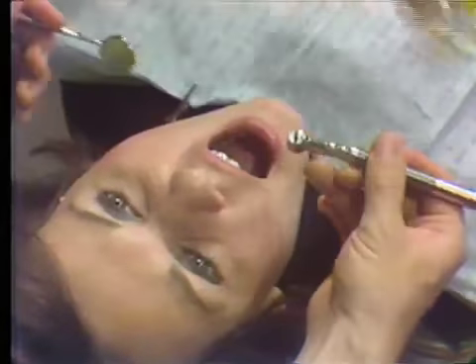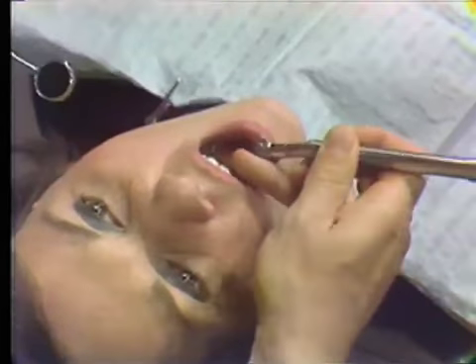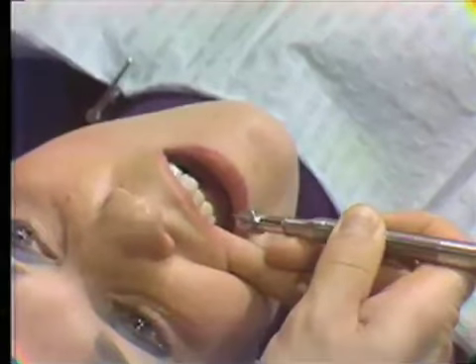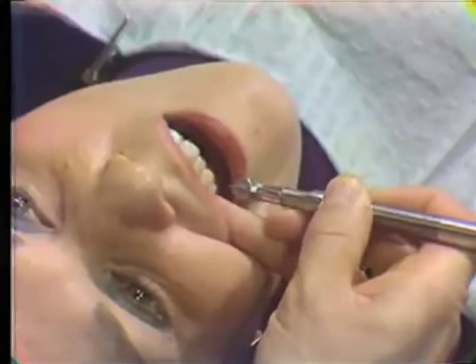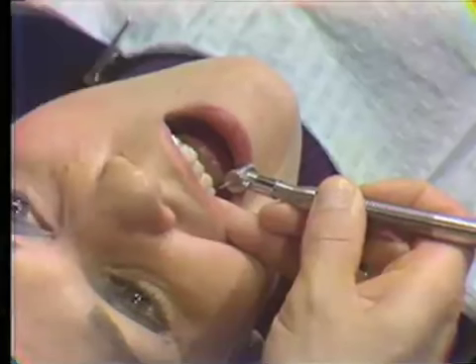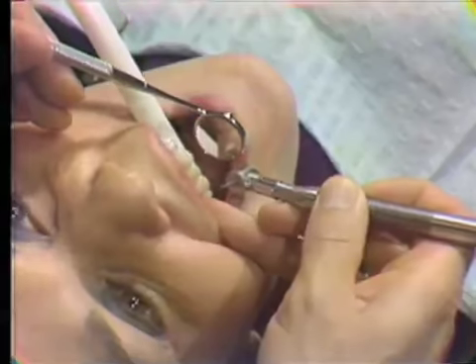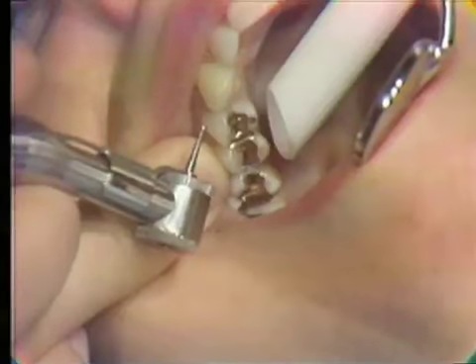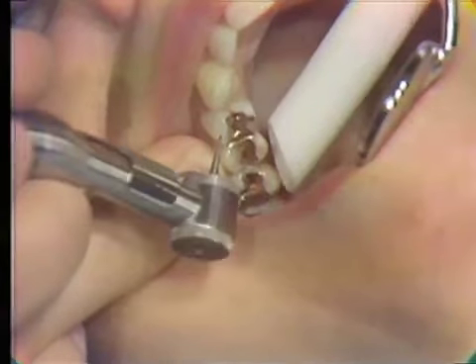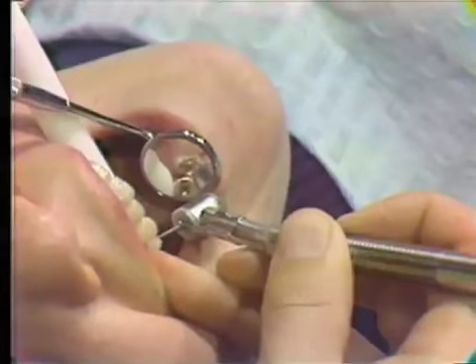Most operators have solved this inconvenience by using the third finger of the right hand to establish a rest against the buccal surfaces of the posterior teeth. The finger also serves to retract the cheek at the same time. A cotton roll placed in the mucobuccal fold aids in the retraction function. The evacuator tip is placed along the lingual surfaces of the posterior teeth with the opening parallel to the surfaces. Due to the supine position of the patient, it is advantageous to place the tip distal to the tooth being treated. Whenever possible, the mirror should be located anterior to the tip to permit freedom of movement of the mirror.